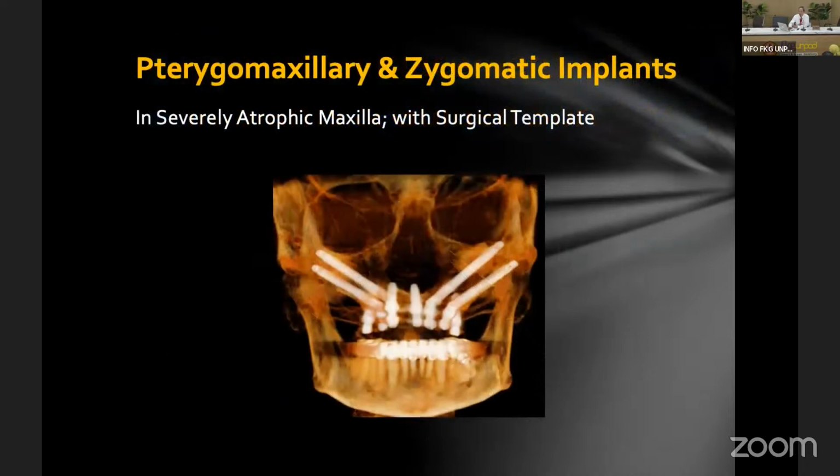implant placement. And some dentists place the implant into the zygomatic bone or pterygoid bone, because if there is a severe atrophy of the alveolar process, you can have the implant go deep into the patient's face to the zygomatic bone. So you can imagine with this kind of surgery, you must need cone beam CT. You cannot just use the panoramic radiograph.